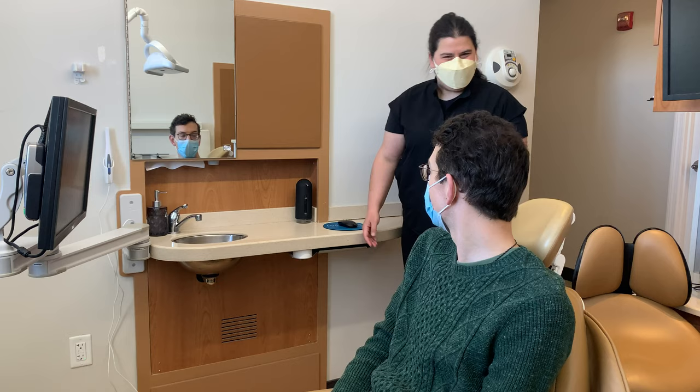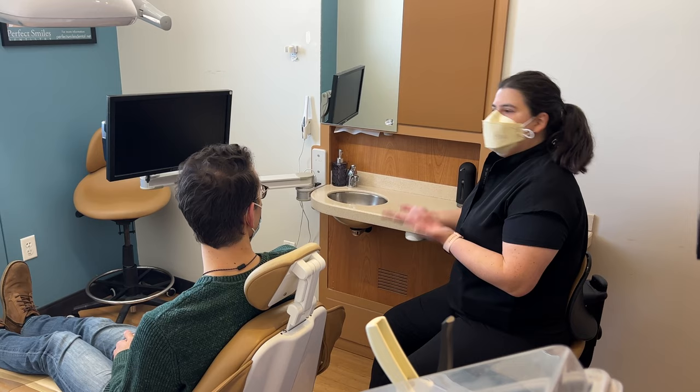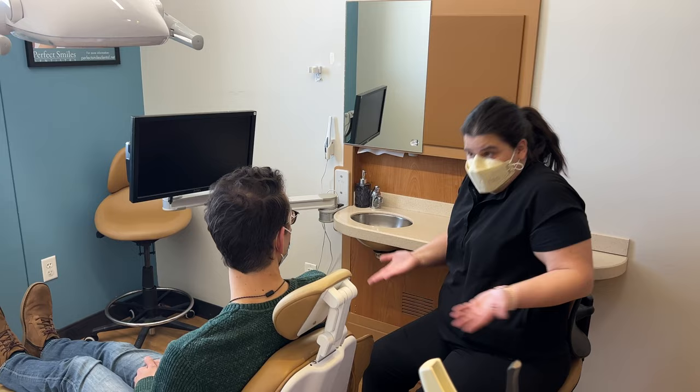That leads me to the monitor. I want to use that monitor when taking images to verify — just like we did in the imaging suite — that my image is accurate and that I got the kind of information that's going to be diagnostically sound for my doctor.